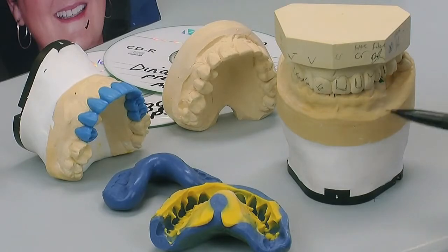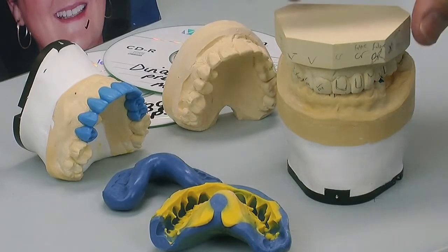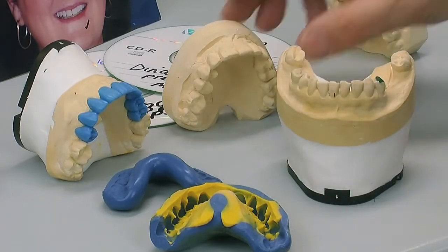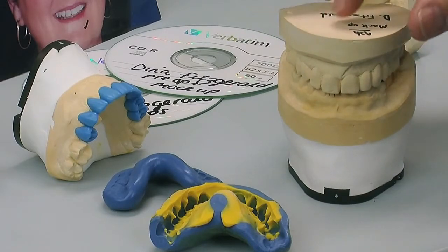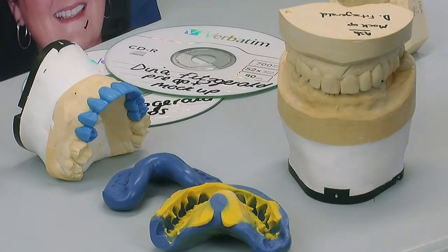We've marked all the areas we need to concentrate on and we've made our own notes in the lab. The great thing about this case is this dentist has actually made us a mock-up in the mouth and taken an impression of that. So effectively we've got a copy of what the patient really likes and what the dentist really likes — and the patient's not numbed up so it's really accurate.